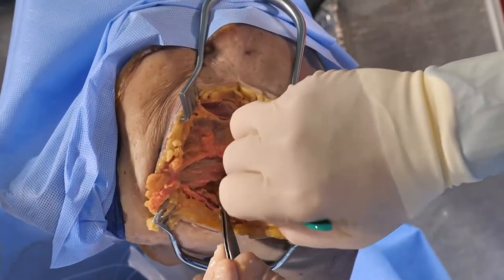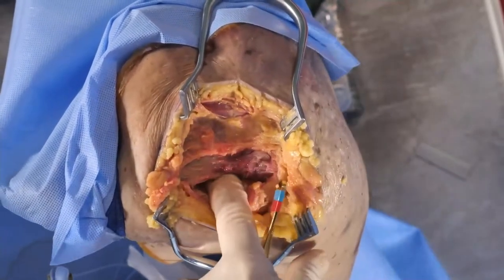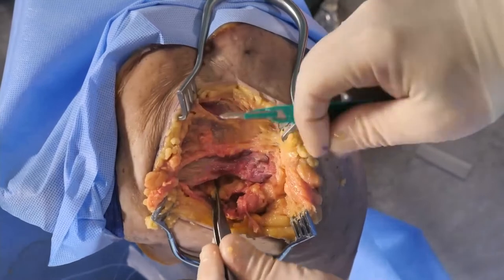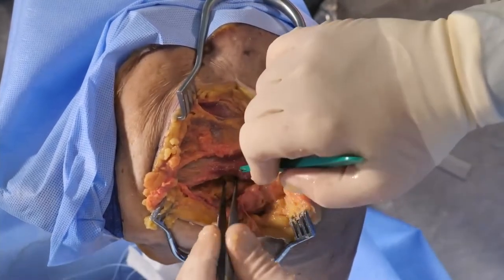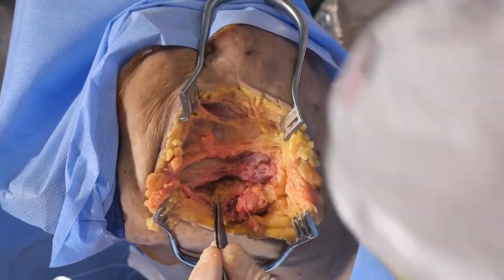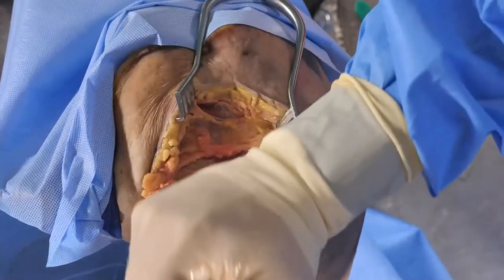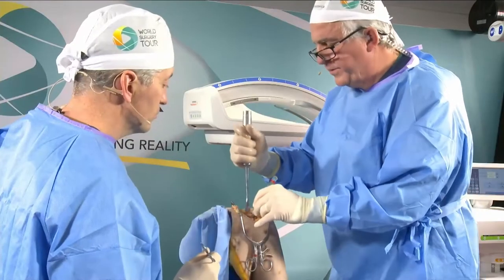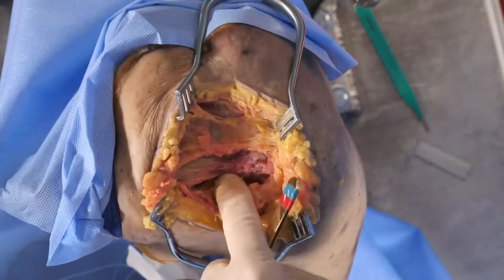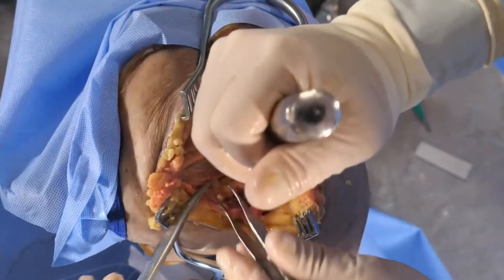I'll take that Cobb elevator, and what that does is we'll go to the curved, convex part of this clavicle and that should drop us right down. I'll take a suture for the deltoid as we come down. A lot of times the clavicle will be posterior subluxated in these cases, and what we don't want to do is come too far posterior because that can lead to injury of the suprascapular nerve. So we'll work our way up.